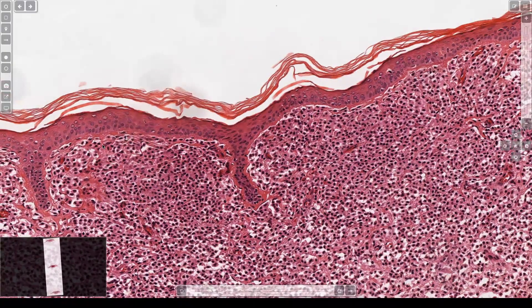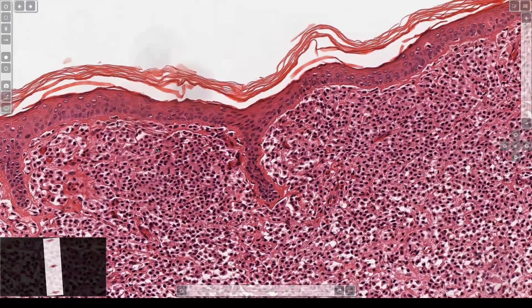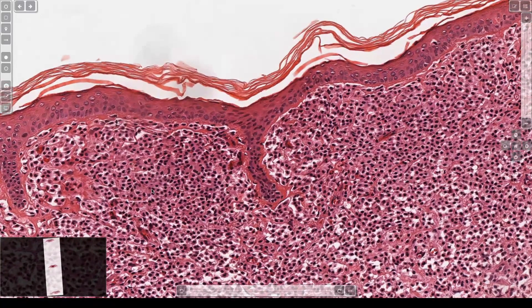The papillary dermis is filled with cells and there is no violation of the basement membrane — these are mast cells. You can see they have the fried egg appearance, and at higher power they have little granules. Stains that will mark mast cells include CD117 or c-kit.